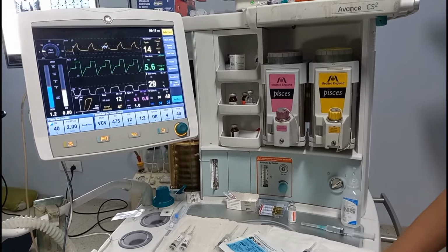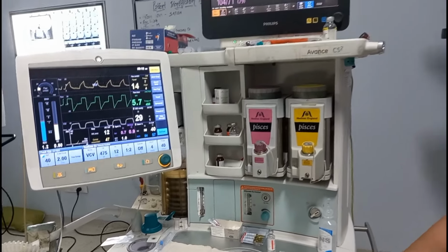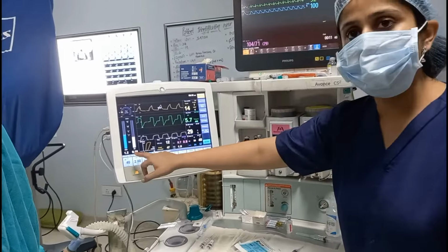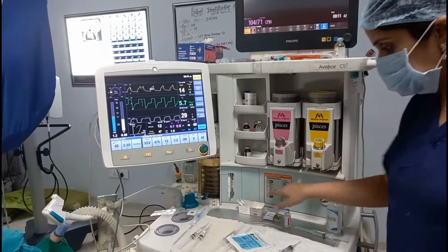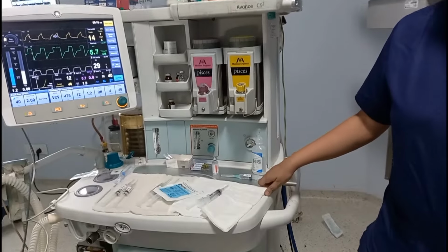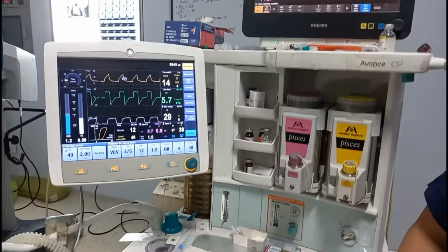This modern anesthesia machine is actually a workstation. This workstation has all the anesthetizing gases, life-sustaining gases, oxygen, and this is the record keeping, and there is a table so that we can place the articles. This all comes in the modern anesthesia machine.